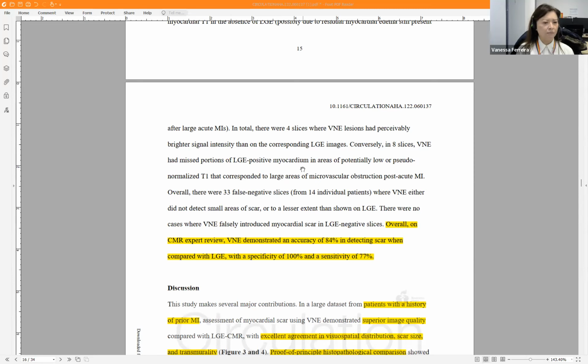And so here, we may need to, as Qiang said, train with more data sets, like more small subendocardial MIs, maybe with dark blood late-GAD, in some way, or we're working on the acute MI data set. Because of the actual T1 values, I think there's a comment in the chat, in an infarct scar, the T1 can be high, it could be pseudo-normalized, or it could be low in chronic scars that have undergone lipomatous metaplasia. And the neural network has to learn to deal with all these things. So it may be a case where it needs to be exposed to many different types of chronic MIs.